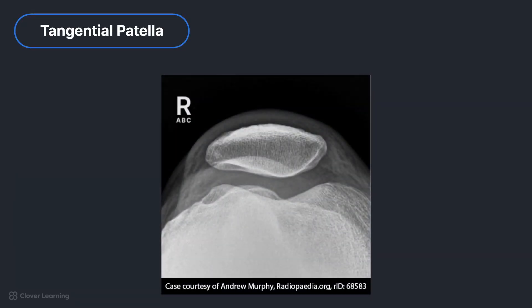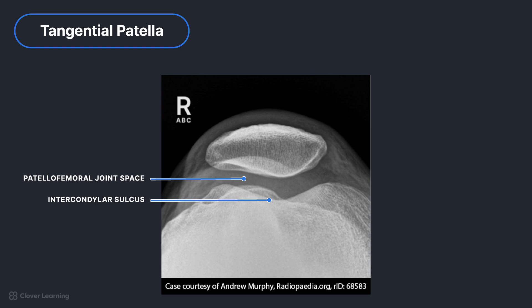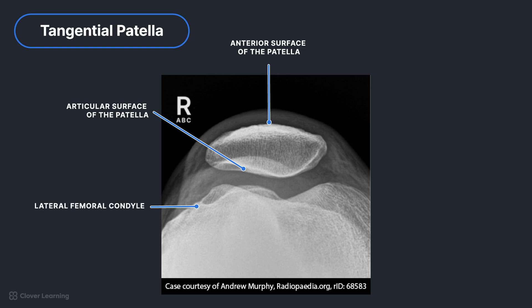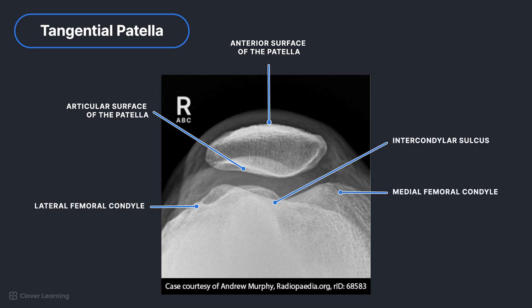Finally, we have the tangential projection of the patella, also known as the axial, sunrise, or skyline projection. There are various methods to achieve this projection; however, the resulting image should be the same or very similar. The goal of this projection is to demonstrate the intercondylar sulcus and patellofemoral joint space. The image shown here is the result of the Settegast method. The tangential projection should demonstrate the intercondylar sulcus, also known as the trochlear groove, and patella in profile with an open patellofemoral joint space. From superior to inferior, we see the anterior surface of the patella, articular surface of the patella, lateral femoral condyle, intercondylar sulcus, and medial femoral condyle.